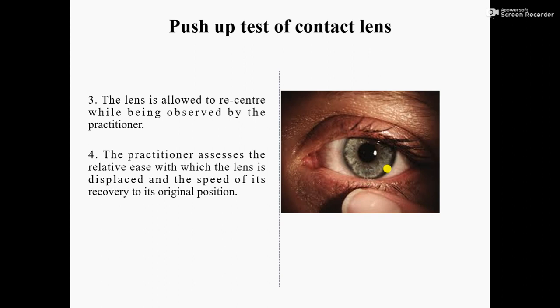Number three: the lens is allowed to recenter while being observed by the practitioner. It means after moving the lens vertically, we have to notice whether the contact lens comes back to center or not.